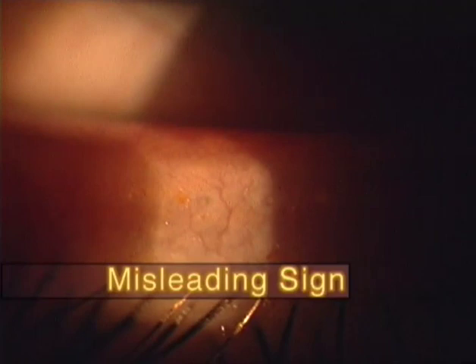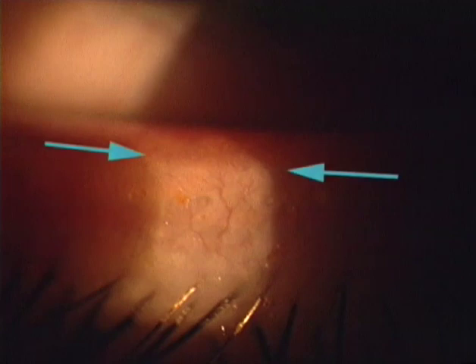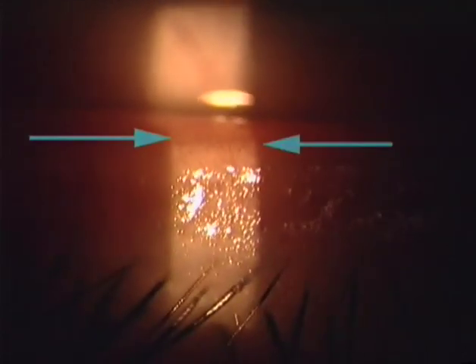Note: the correct diagnosis of the mucocutaneous border may be jeopardized by conspicuous changes in the subepithelial layer. For example, here, where a change in color along the margin seems to indicate the border. But actually, this color change, as revealed by the examination in specular reflection, does not correspond to the delineation of the rugged reflex.